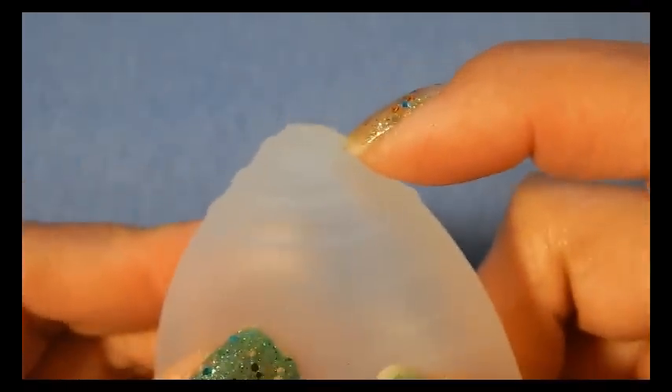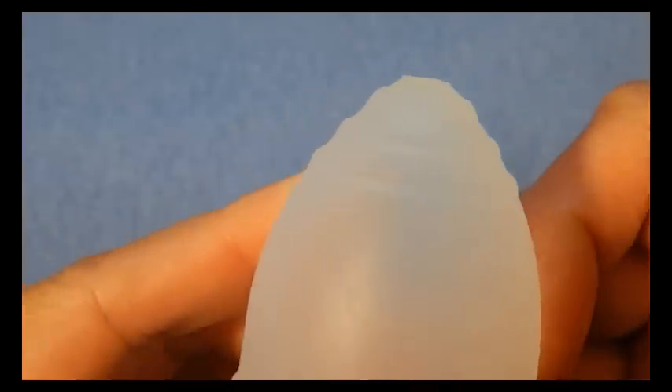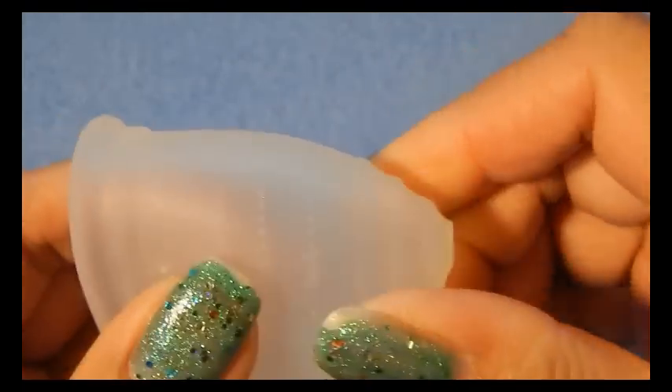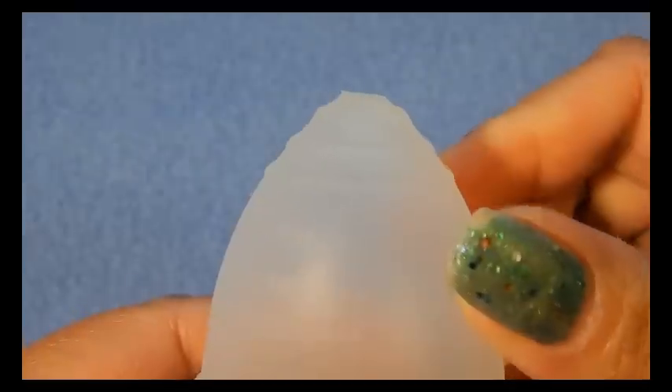The Ruby cup grip rings give a muted sound, and although they are smooth, they do still give a nice grip when you are trying to remove your cup.